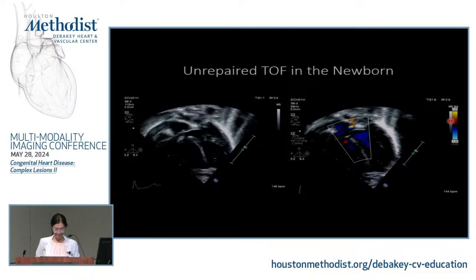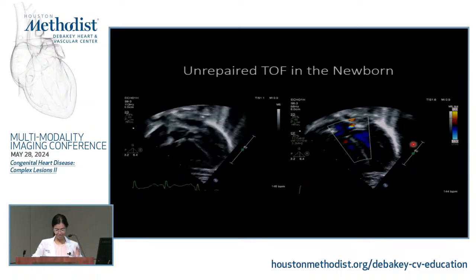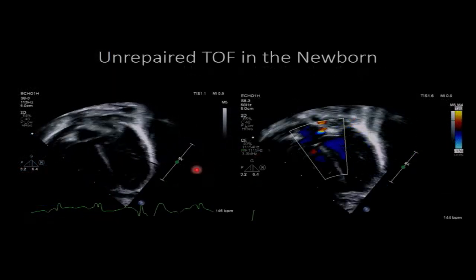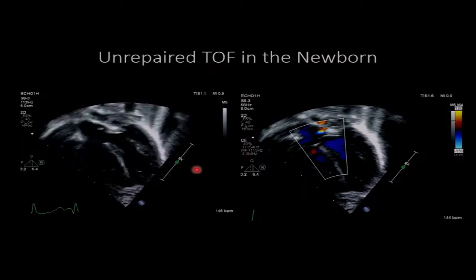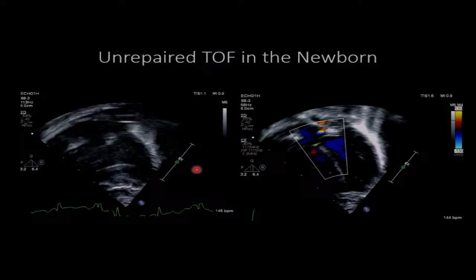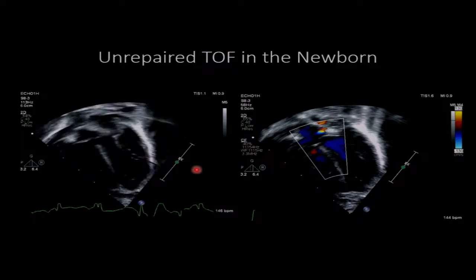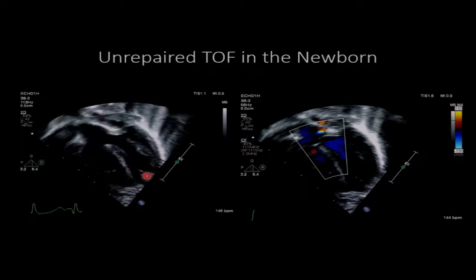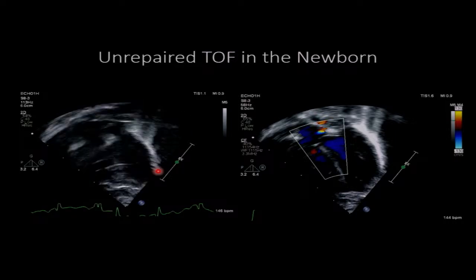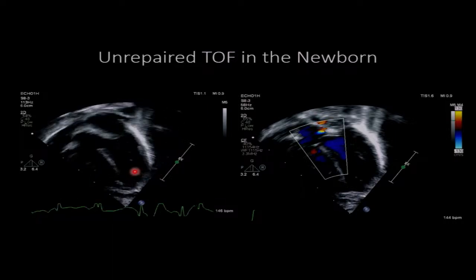Okay, so here you're not used to looking at this, but I love showing it to you. This is what congenital echoes look like in the newborn. Pediatric cardiologists look at the images in a different orientation than we do, but you guys can understand this. This is equivalent to your 4 or 5 chamber views.